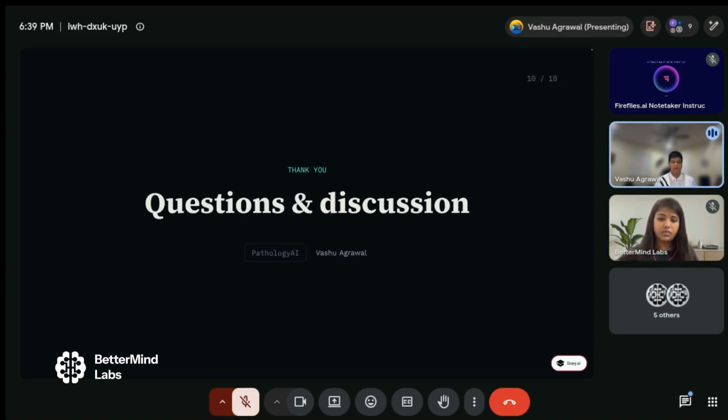That's why I chose to run it locally in the early stages, because most pathologists are already given these computers. But in the future, I want all these models hosted somewhere, not running on a computer. To your question, you can run however many your computer allows, and in the future it's going to be the same thing, but instead of a computer running it, it's going to be a GPU of some sort.